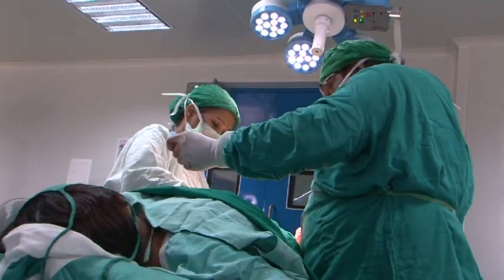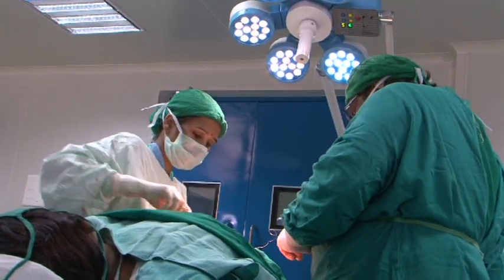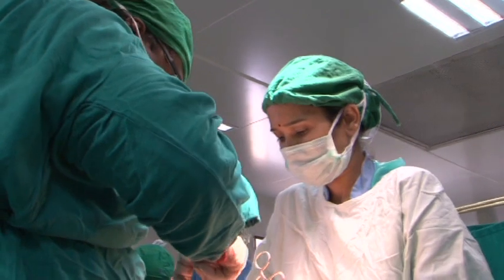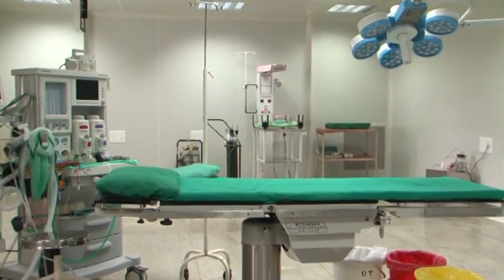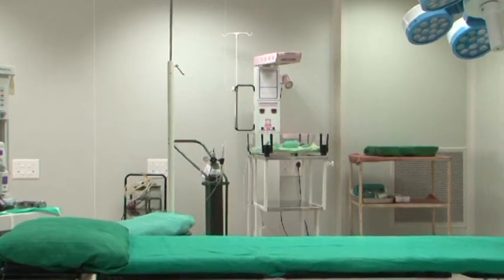The obstetric operation theatre should have a separate tray of pre-autoclaved and wrapped instruments in sufficient numbers so that one set is available for each cesarean section. Maternity operation theatres should also have a newborn care corner with all accessories and equipments.